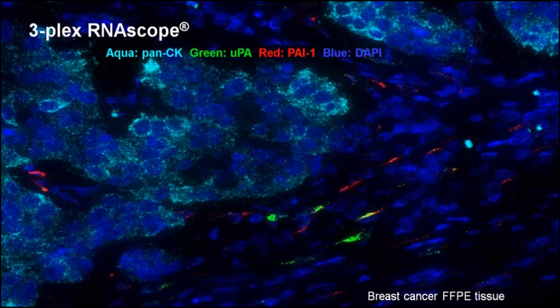Now, because it's not easy to get 300 milligrams of fresh tissue, people always looked for alternatives for this test. They tried IHC, and it doesn't work because these plasminogen activator molecules are secreted. They tried to apply PCR on laser capture cells, and they couldn't confirm the finding from the microarray.